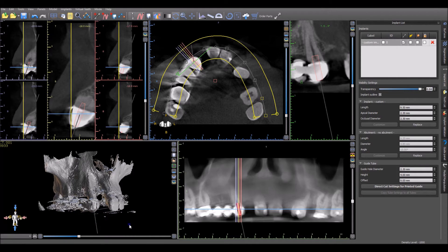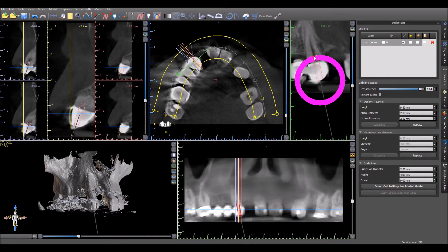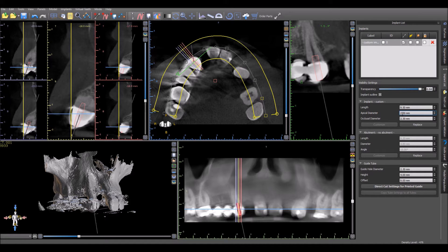Place an implant in the location to access the root canal. The implant should be placed so that the bottom of the implant reaches the top of the calcified canal. The implant diameter should be set to be a tenth of a millimeter larger than the tool that's going to be used for the root canal.